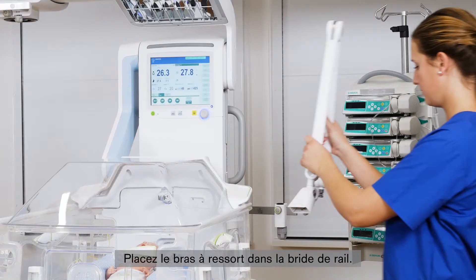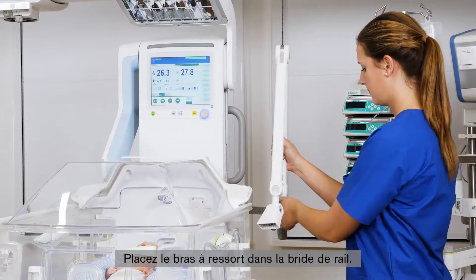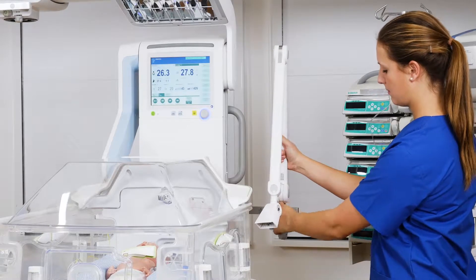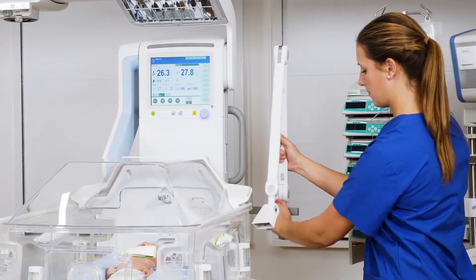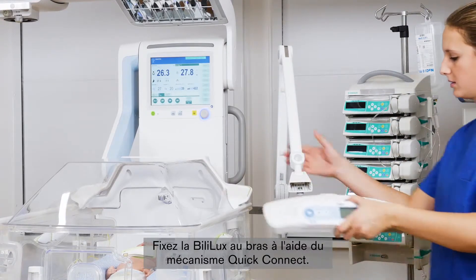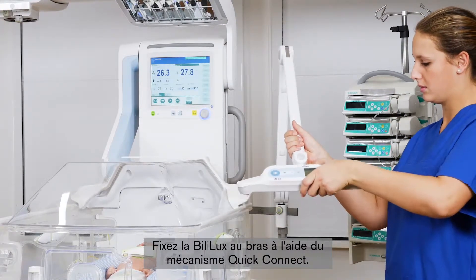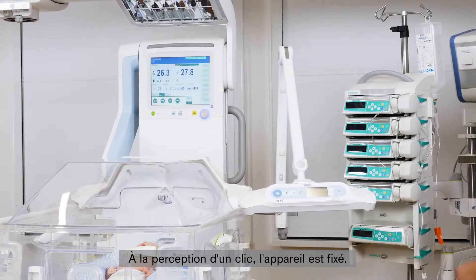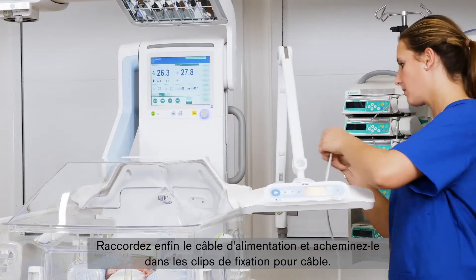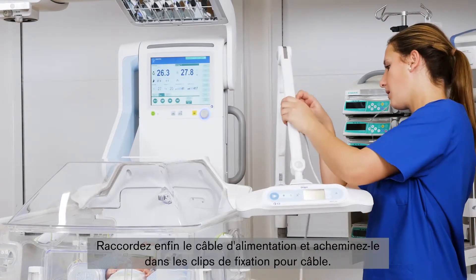Take the spring arm and place it into the rail clamp. Then take the Bililux and attach it to the arm by using the Quick Connect mechanism. As soon as you hear the clicking sound, the connection is fixed. Finally, attach the power cord to the device and guide it through the cable clips.